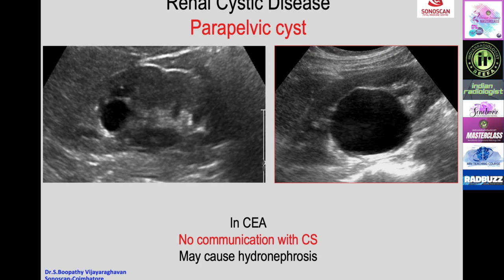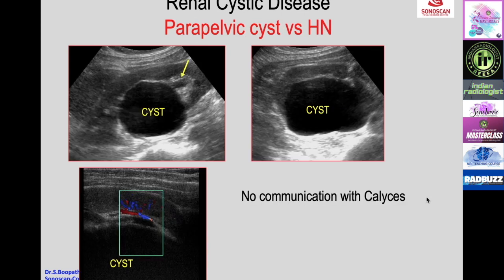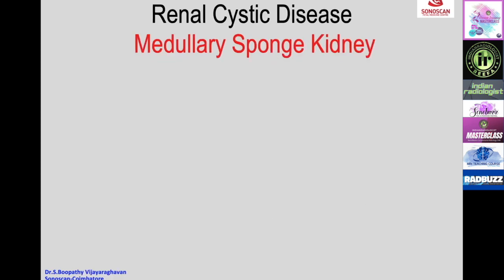A cyst can be parapelvic in location, appearing in the central echogenic area and potentially mimicking hydronephrosis. However, there is no communication with the calyces, the location is eccentric, the parenchyma is seen on one side, and the renal pelvis can be seen separately from the cyst. These are the diagnostic features for a parapelvic cyst.